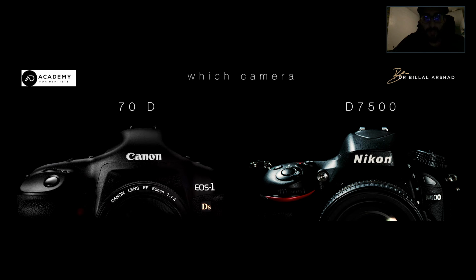What about the actual camera? There are lots of cameras out there. Canon and Nikon seem to be the main ones that we're using on a day-to-day basis. For me personally, I'm a Nikon man, and if you're going for a cropped sensor, then you're looking at a D7500, or something similar for a Canon would be a 70D. For a full frame, if you're going for a Nikon, then a D850 would be your option.